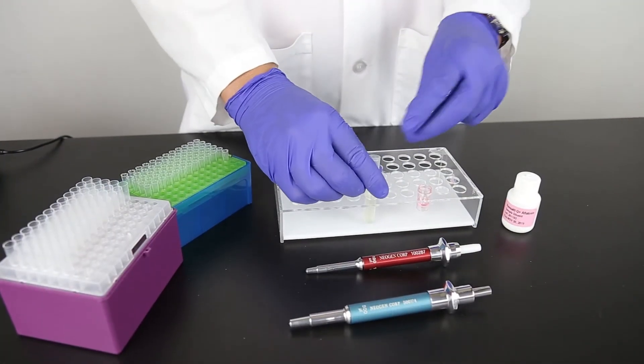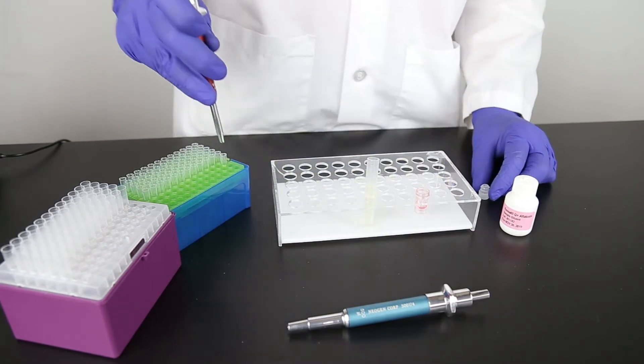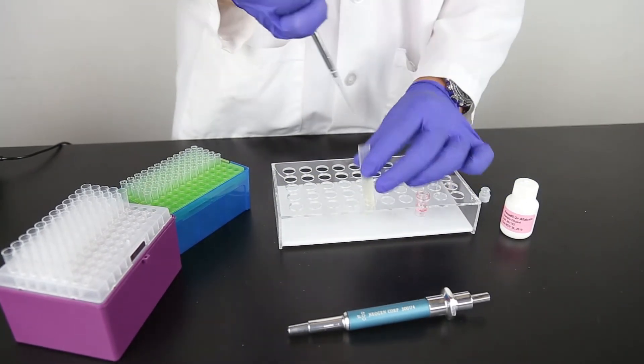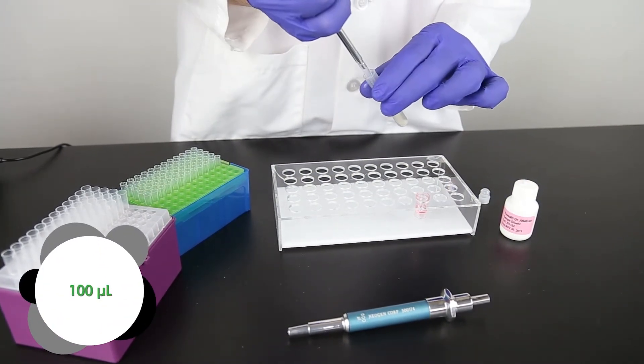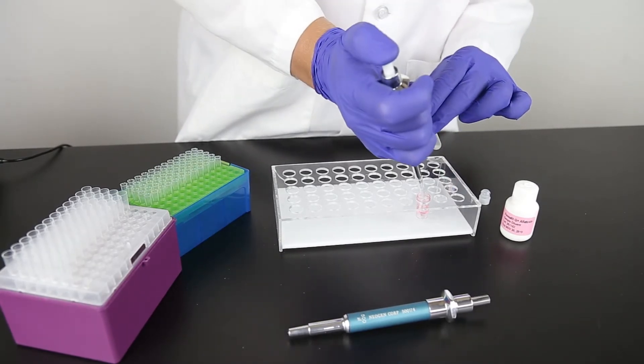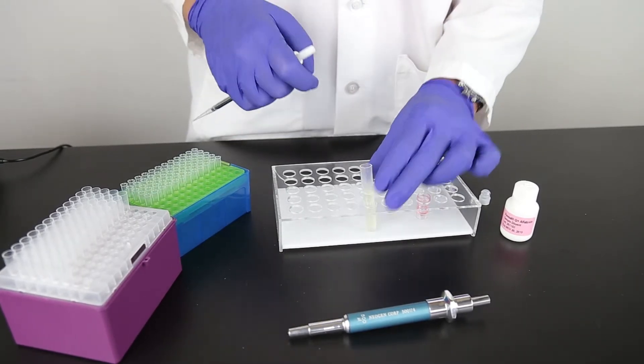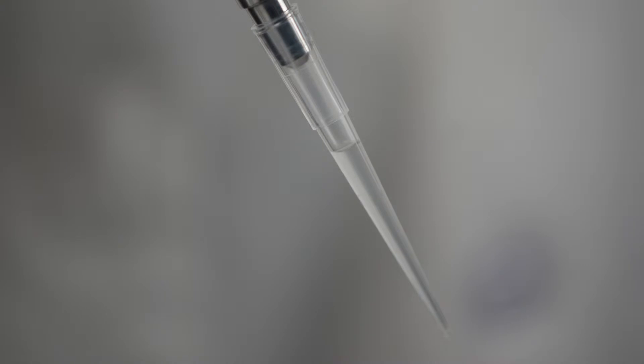For each sample you are testing, place a red dilution cup into the sample rack. Add 100 microliters sample to the red dilution cup. It is important to make sure the pipette tip is fully charged with liquid and doesn't have any air bubbles prior to dispensing the liquid into the cup.